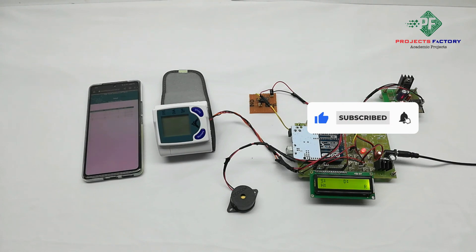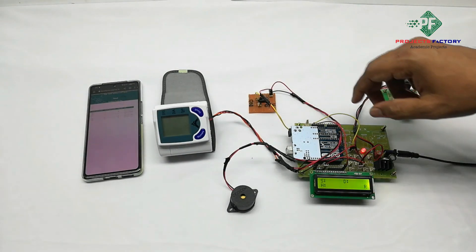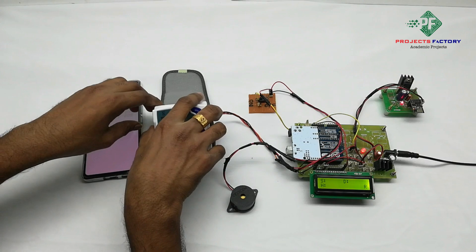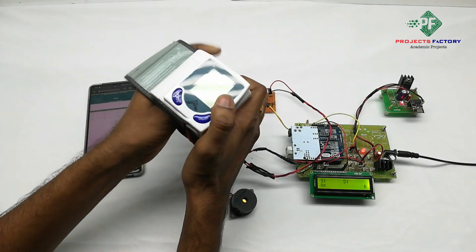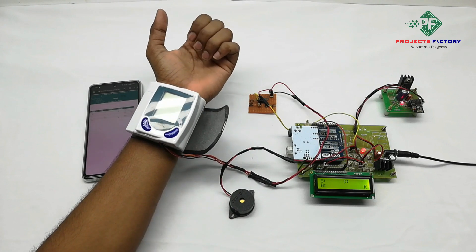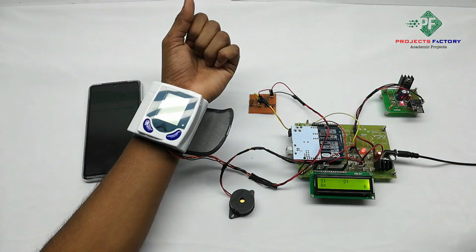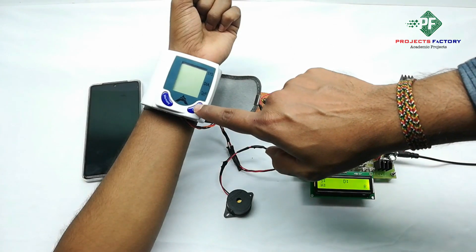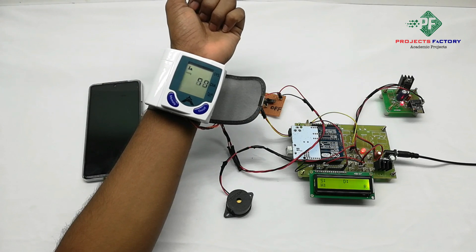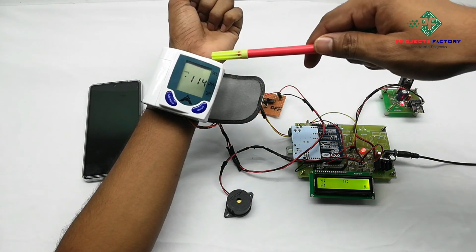Now we will see the project in operation. We turn on the switch and hold the sensor to the left arm wrist. Keep the wrist projection parallel to our heart. Sitting position gives good results. Now we press the on button. It is calculating and sends the data to the Arduino, and Arduino updates the data to the IoT cloud server.